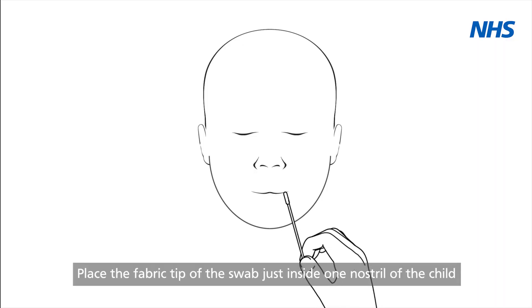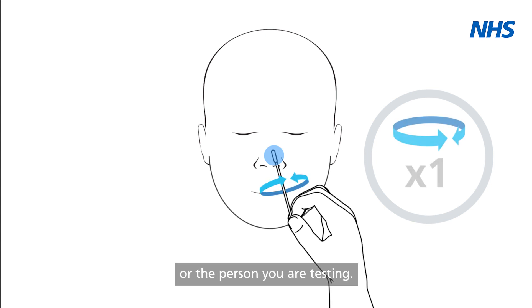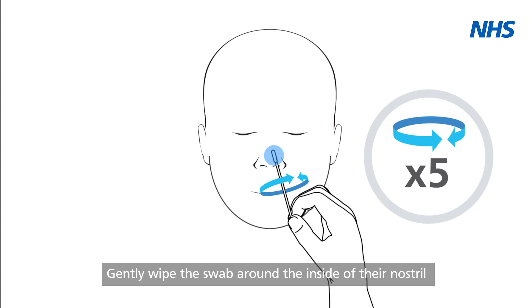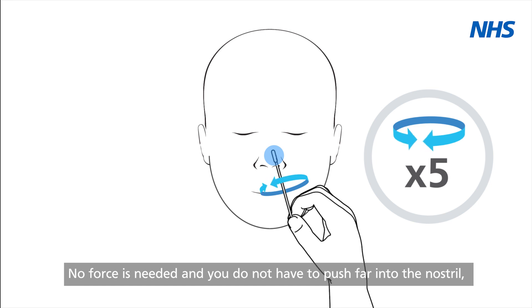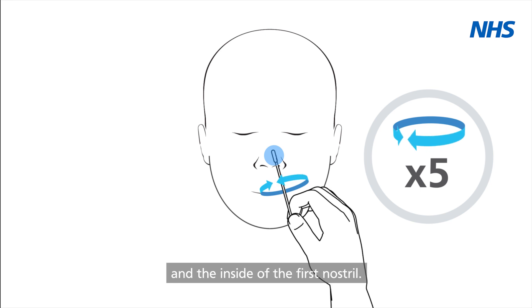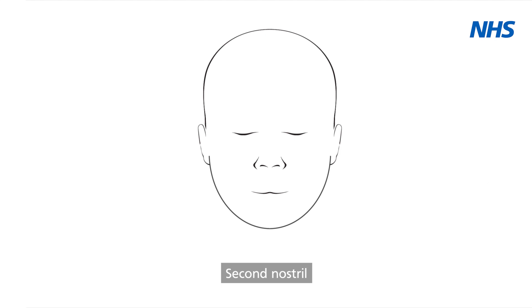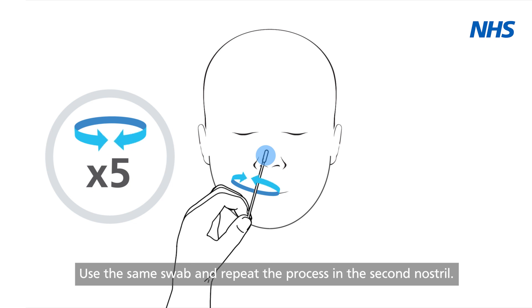First nostril: place the fabric tip of the swab just inside one nostril of the child or the person you are testing. Gently wipe the swab around the inside of their nostril in a circular motion five times. No force is needed and you do not have to push far into the nostril. Make sure there's good contact between the fabric tip of the swab and the inside of the first nostril. Second nostril: use the same swab and repeat the process in the second nostril.